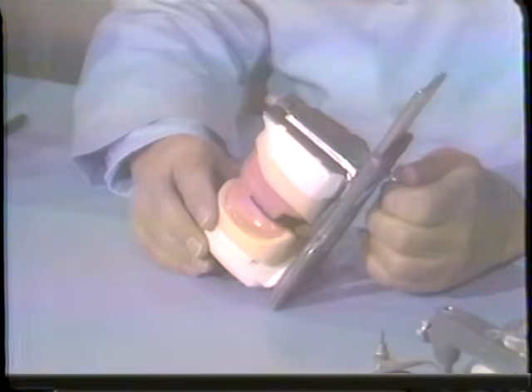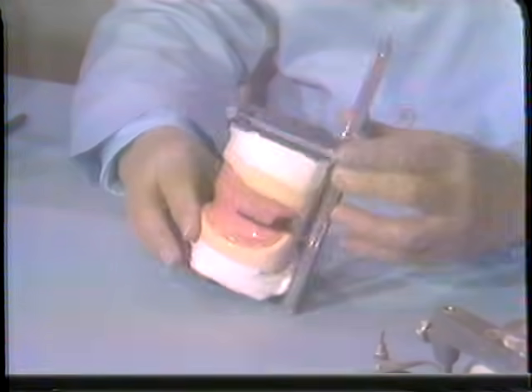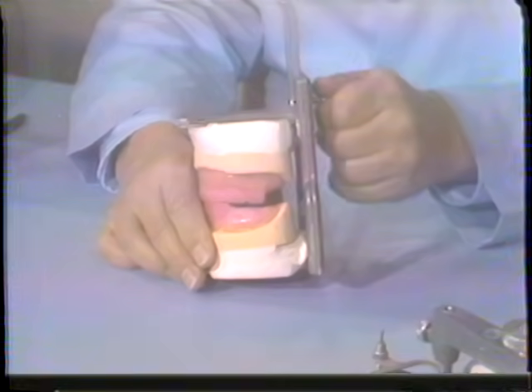Now, a centric relation record is required for every instrument, no matter what the design might be. But in this first one, which is called a centriculator, it moves only in a vertical direction, just up and down.